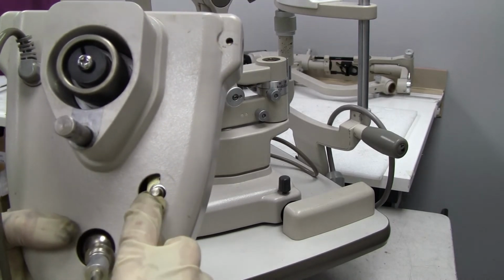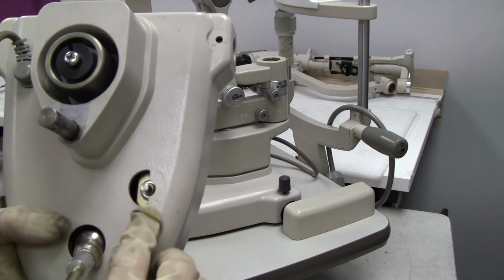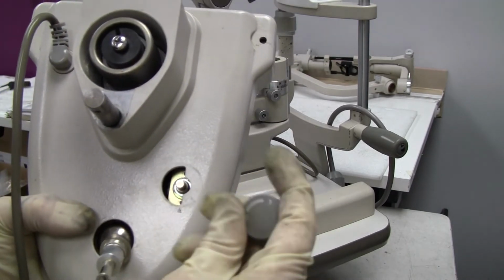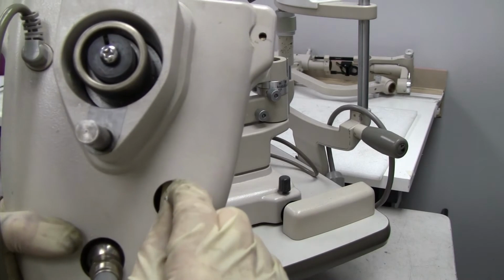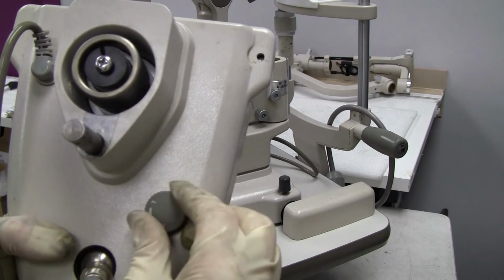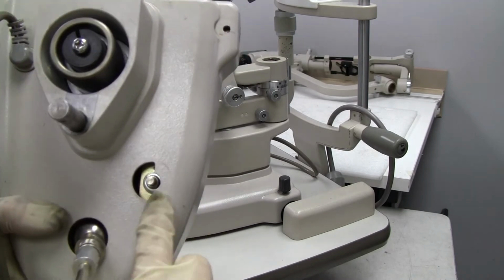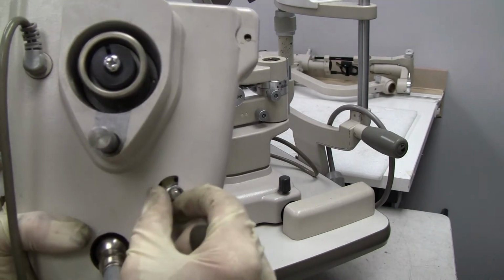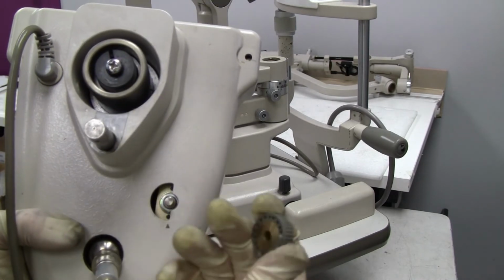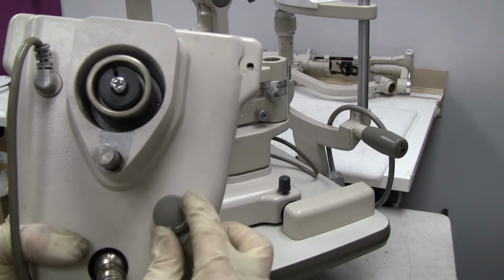Your limits can change. So if you want to adjust your rheostat so it's brighter, then you would take your knob off and turn it up a little bit, and then put your knob back on so that your span reflects what you want. If you want it to be dimmer, then you would turn it down after you take your knob off, put it in, and then it would only go up so halfway.